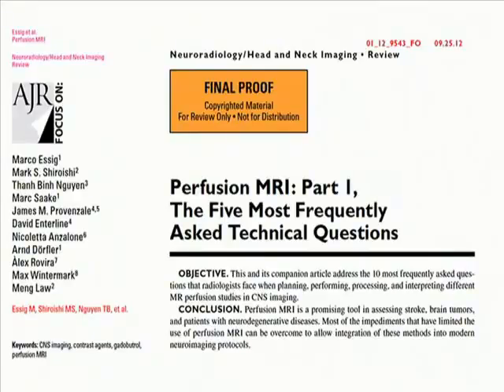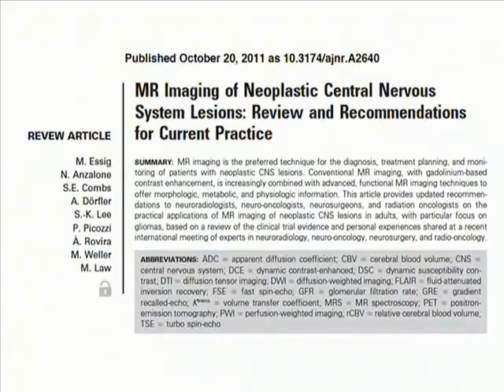And there has been tremendous work done. Just a few highlights over the last couple of years. There have been some general recommendation papers out. What are the most clinical and technical questions on perfusion? This is one that came out just last year. And the protocol recommendations have also been updated, both in tumor imaging, MS, stroke imaging.